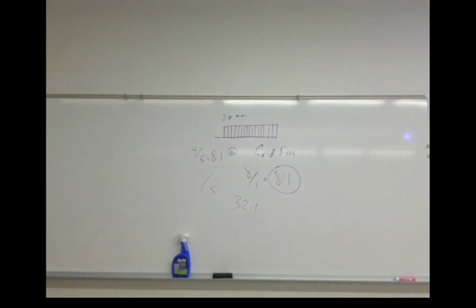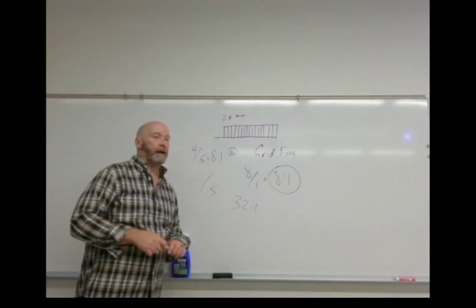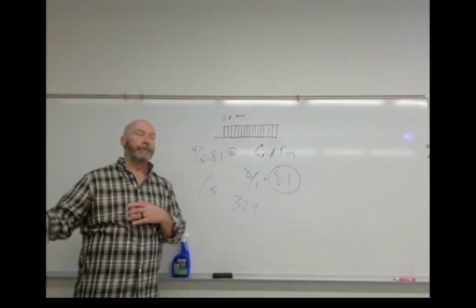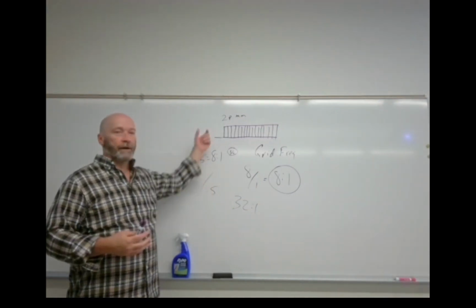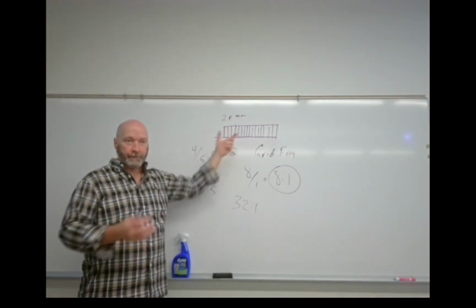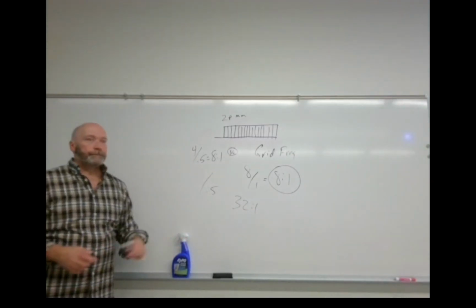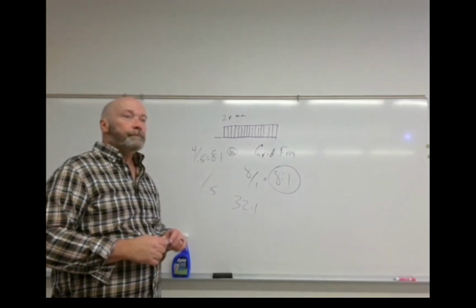So on the test, how would you ask about grid frequency? Would it be more math-based questions? No, it'd just be, what measure of grid effectiveness would be described by the number of strips within a millimeter? Grid frequency. Yeah, it'd just be a description. Okay. So you're not going to ask us to change the grid frequency and figure out what the new ratio would be?